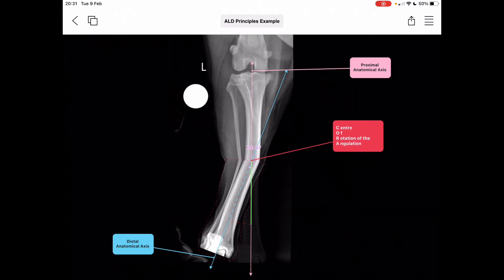In this first slide, we have a craniocaudal projection of a canine tibia, and for the purposes of illustration, we've made an obvious artificial deformity in the mid-diaphyseal region. When referring to limb deformities, we talk about the plane of the deformity in which we can see the deformity. This deformity example on screen is in the frontal plane, meaning we can only see it from a craniocaudal or caudocranial perspective.